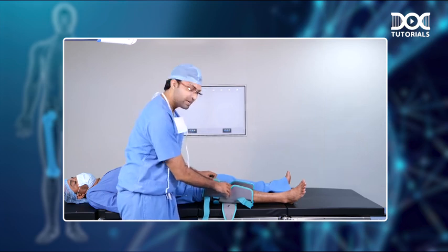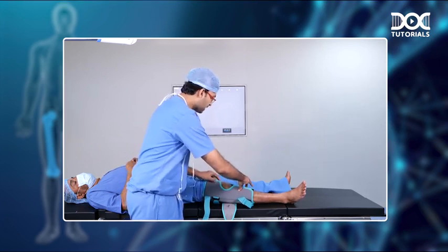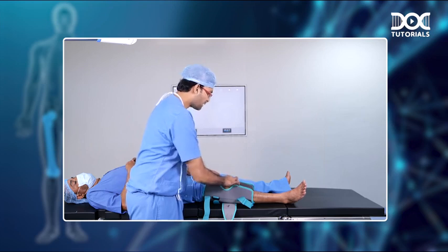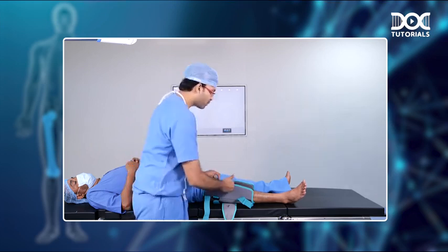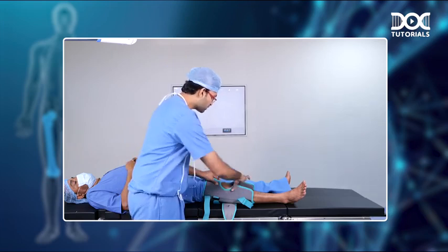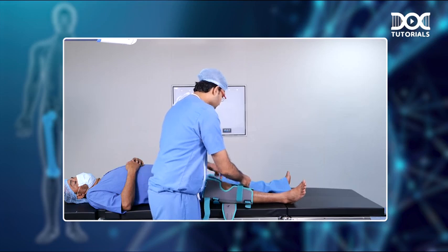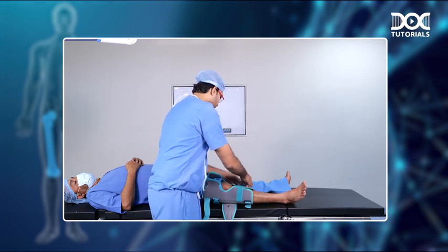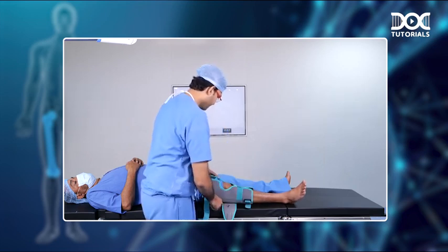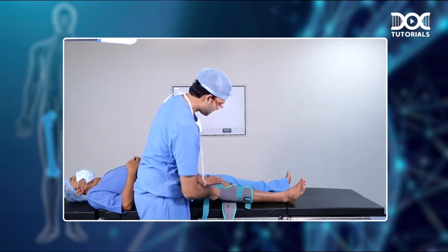All the knee immobilizers will have this kind of an opening in the front, and that opening should correspond to the patella. That is the important point. It should not go below, it should not go proximally. The patella should correspond to this opening. Once that is achieved, then the rest is easy. You can just strap the device on like this. These are all Velcro straps which you can just easily apply.